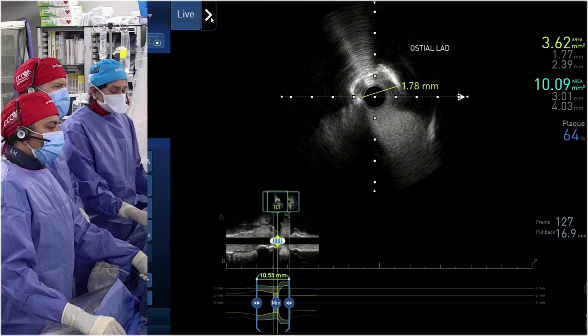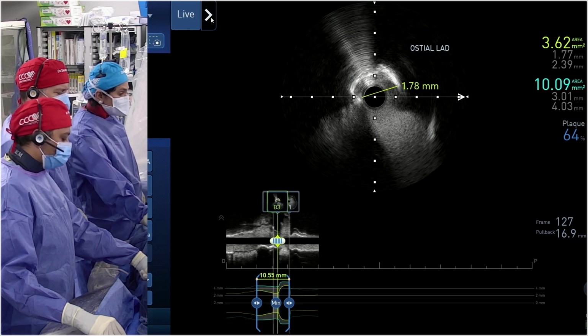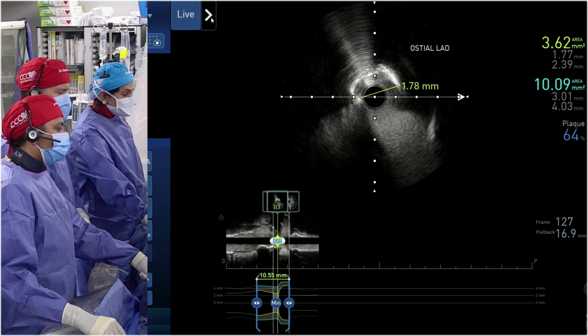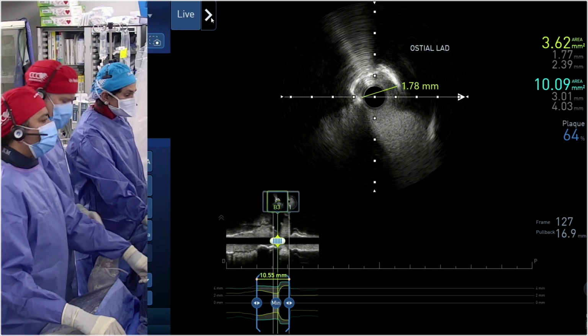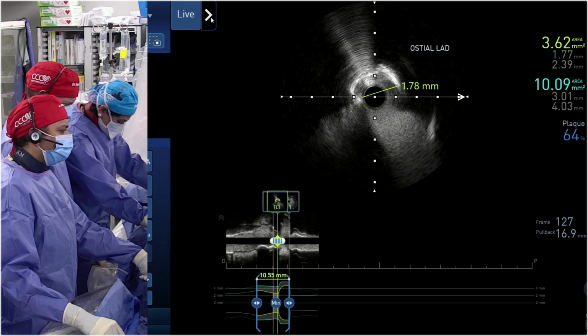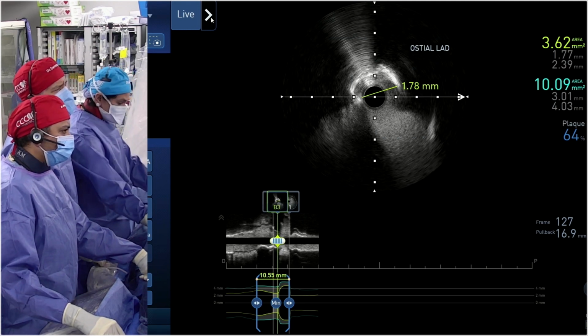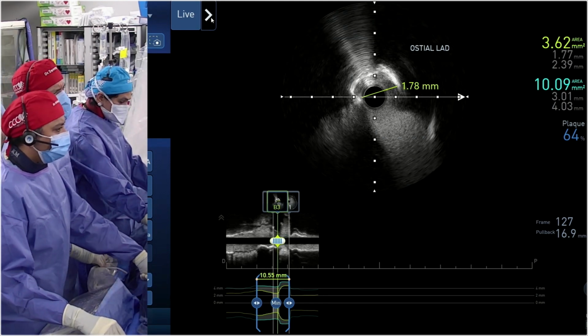Yeah, first of all, this is a very interesting situation which we see in clinical practice, that we have coronary artery disease and severe aortic stenosis together, and the question becomes which one to treat first. You can come back, Angel. So here, since the PA pressures were so high, it appears that it is primarily because of the critical aortic stenosis that the PA pressure is elevated.